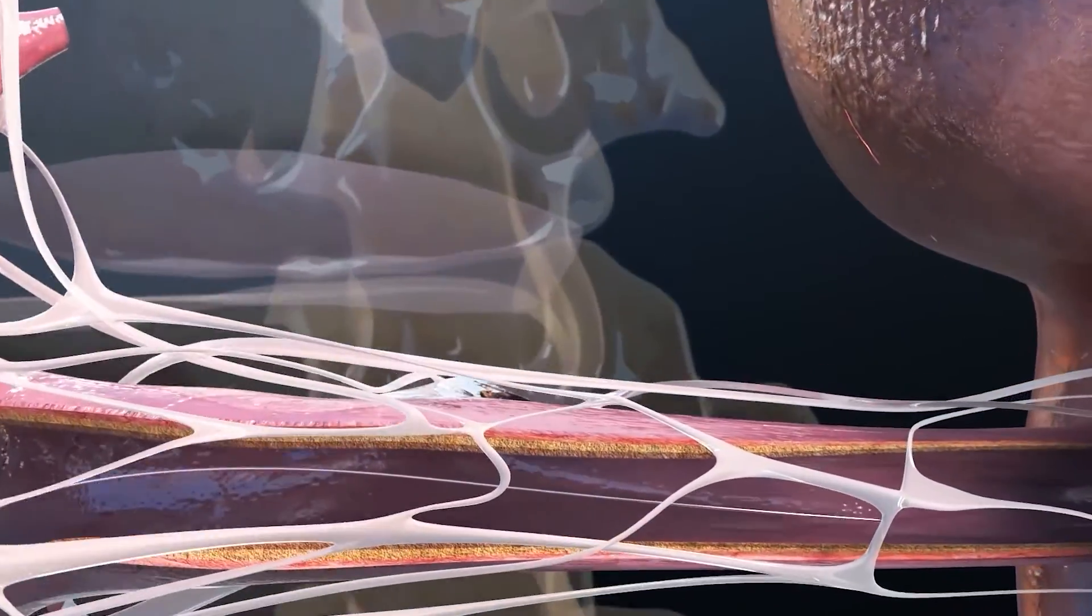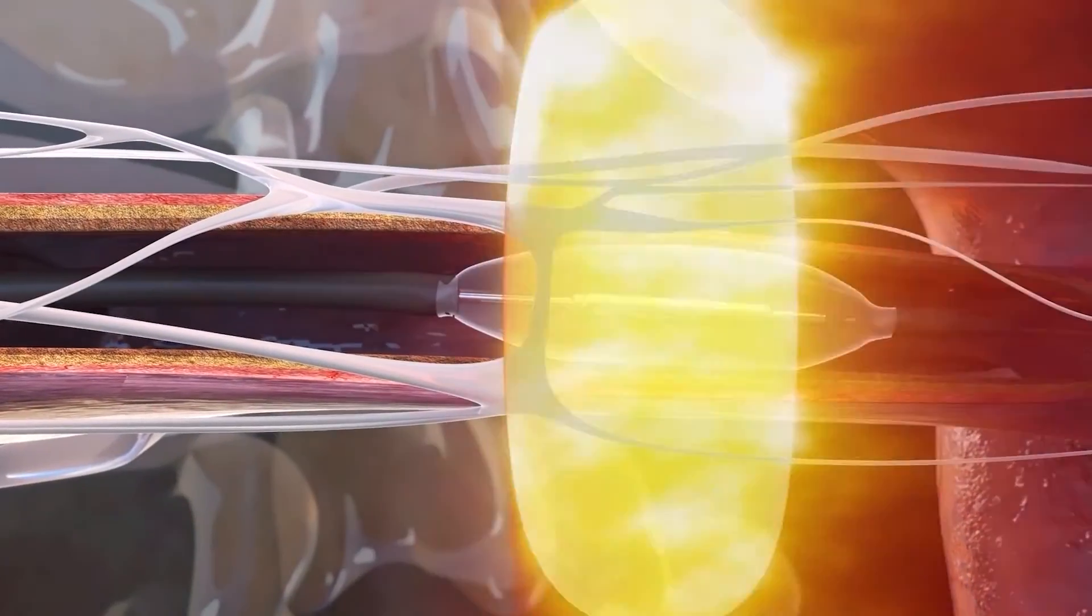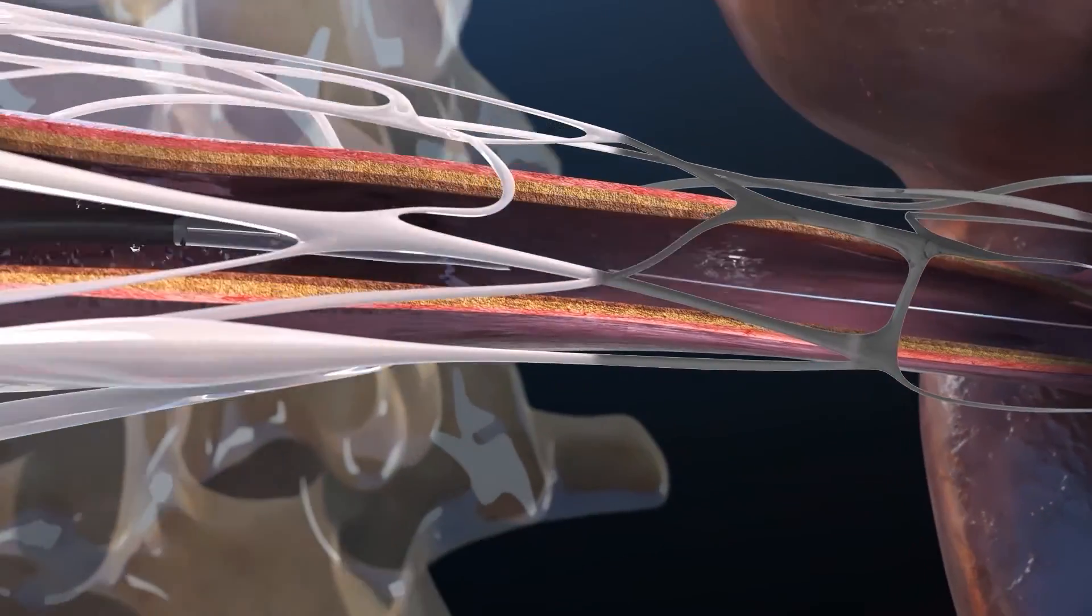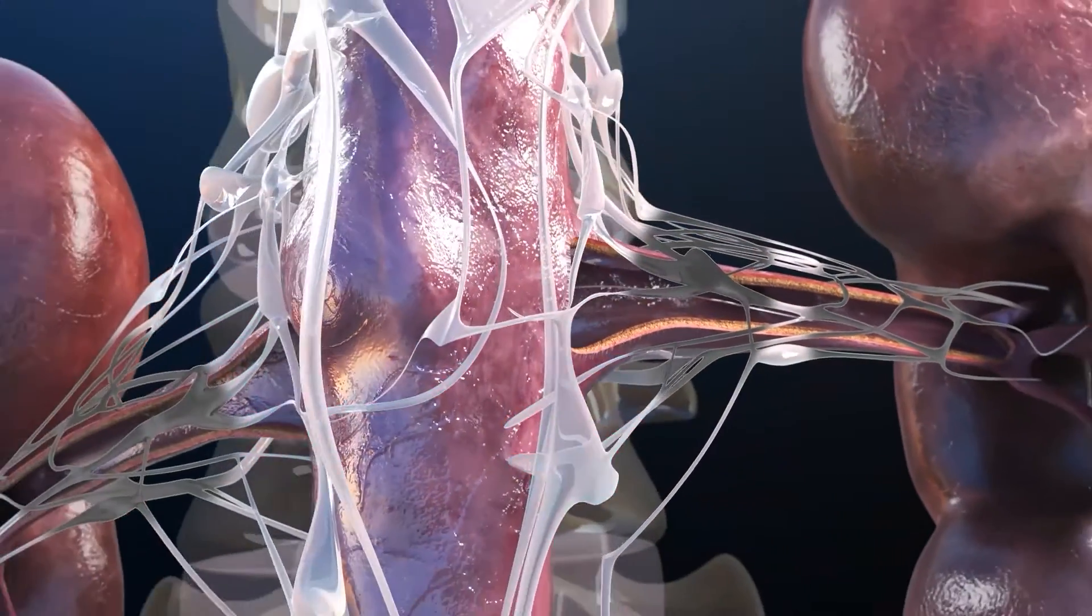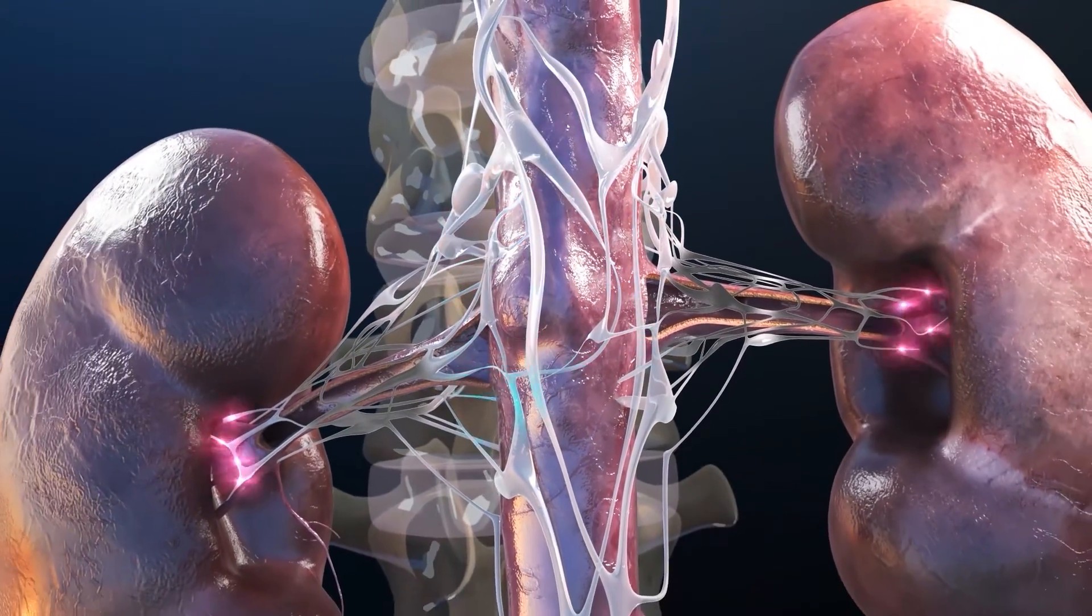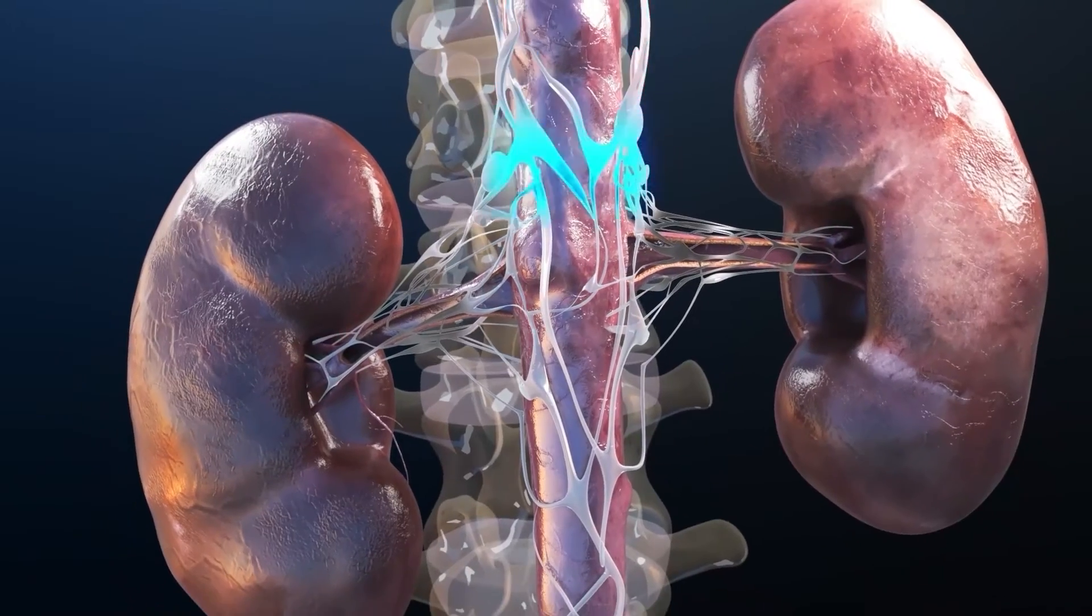The procedure is repeated on the contralateral renal artery to achieve bilateral denervation with another two to three sonications of seven seconds each. The total sonication ablation time across both arteries is less than one minute.